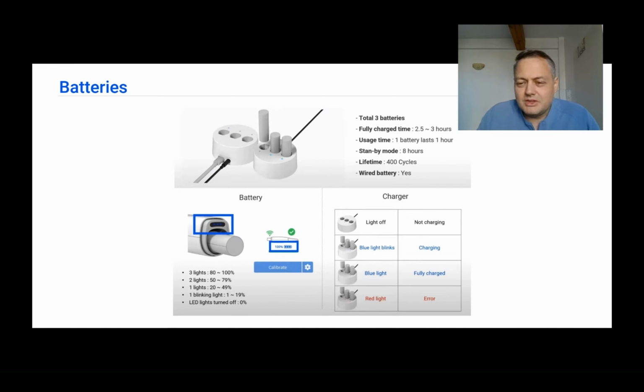That plugged-in battery is not a wired connection to the scanner. It just gives juice to the scanner. So you still will have to be able to connect to the base, and the base is still needed. As you see, the charger symbols are displayed below, and you also know, as I mentioned before, how much juice you have left in your batteries, so take that into account.